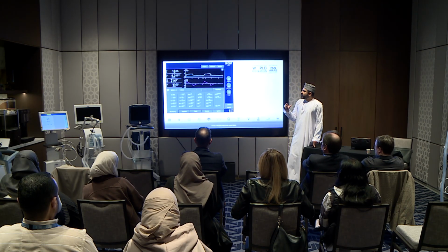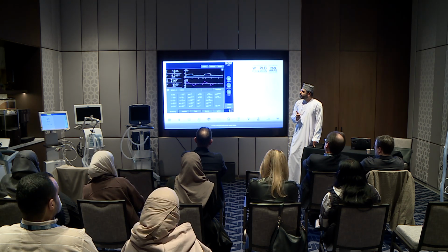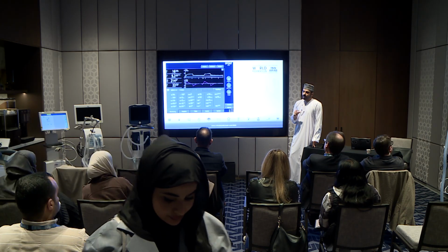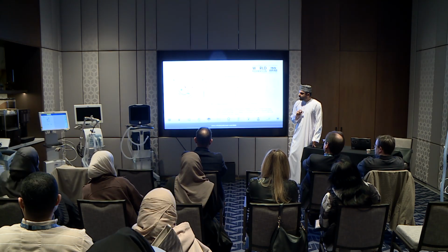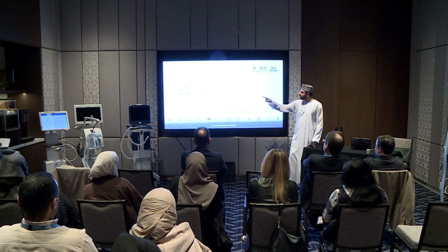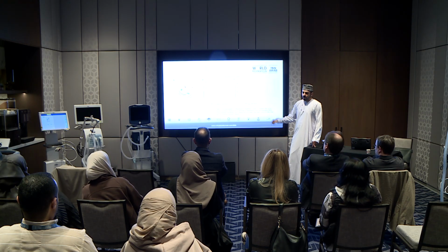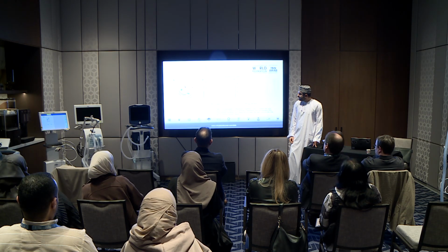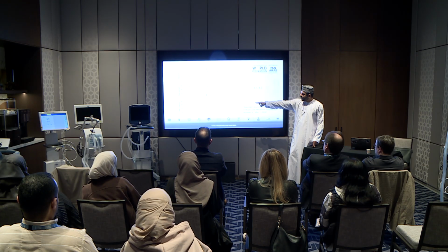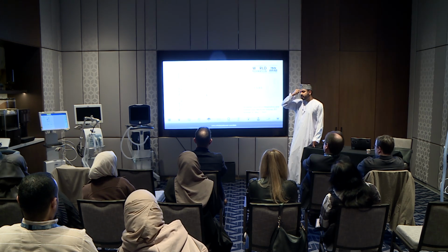And if you want to know if this occlusion pressure at 100 milliseconds is really representative of the respiratory drive and the neuronal input, there is a study that actually looked at the correlation between the occlusion pressure and the electrical activity of the diaphragm in healthy subjects. And actually, it is well correlated, and you can use it. And this is also another study which shows you the occlusion maneuver as well as the esophageal pressure at 100 milliseconds, and there is a good correlation between them.